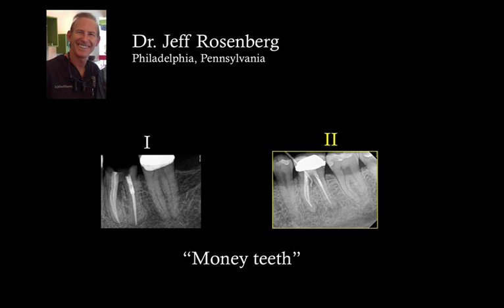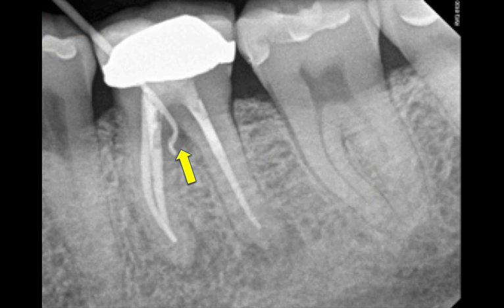It'll give you some background on how to identify challenges from one periapical radiograph. There's so much information that you can learn from one radiograph that can help you predict problems and prepare for them ahead of time and make your life much easier and with less stress. So here goes case number 2.